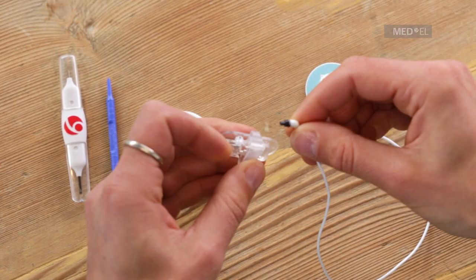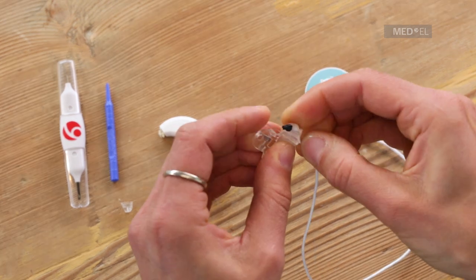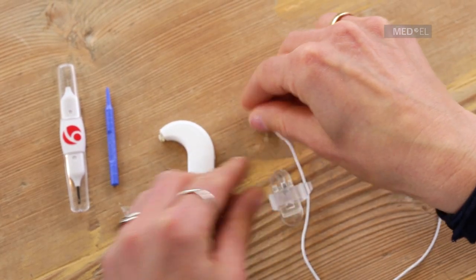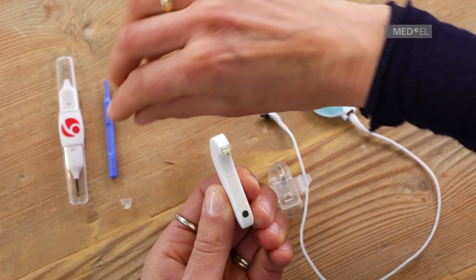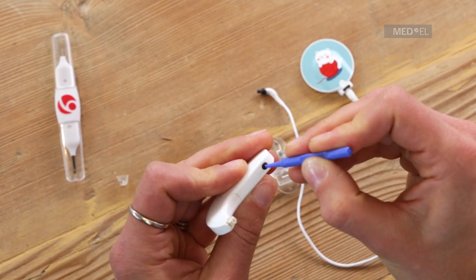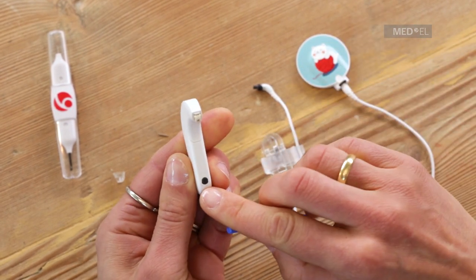Thread the cable through the side loop of the attachment clip. To attach the cable to the audio processor, first check that the battery pack cover is in the horizontal unlocked position. If it is in the vertical locked position, unlock it with a plastic screwdriver.